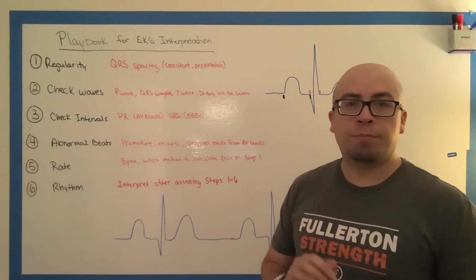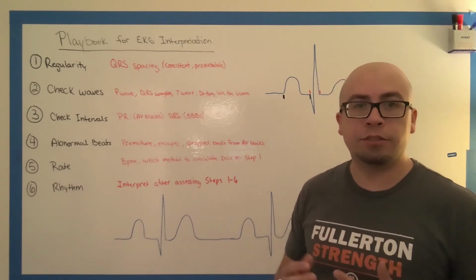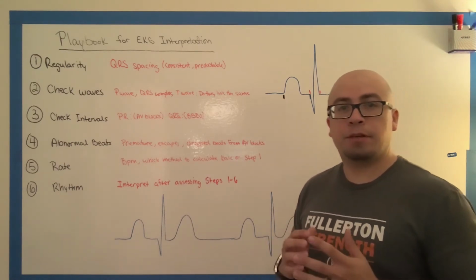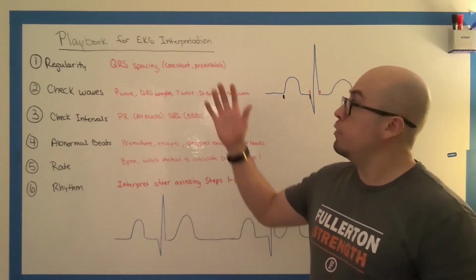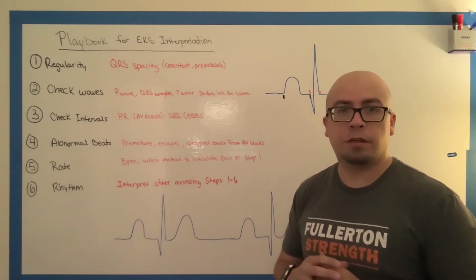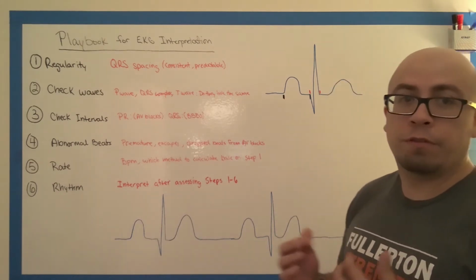Today we're going to cover the playbook that I've put together on how to interpret EKGs. So if you're new to the channel, welcome. This is going to be a step-by-step basics on interpreting EKGs. I put together a little playbook. You follow the playbook, you'll be able to interpret EKGs like a professional. All right, the first thing we want to do is be familiar with all of these steps.